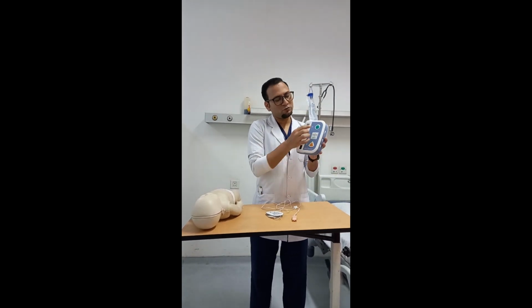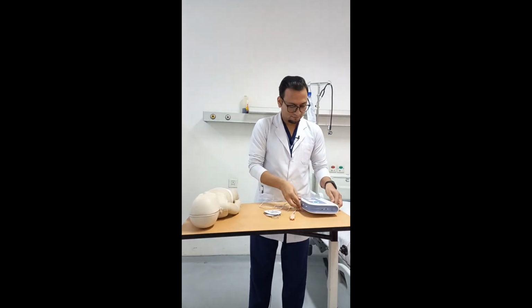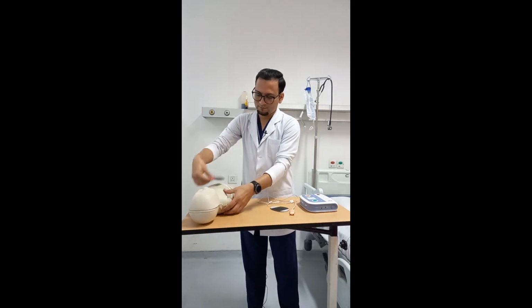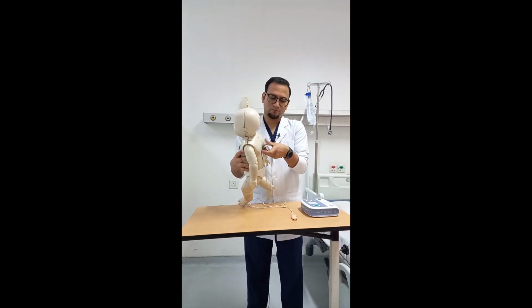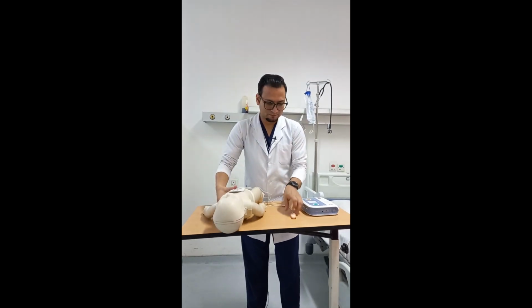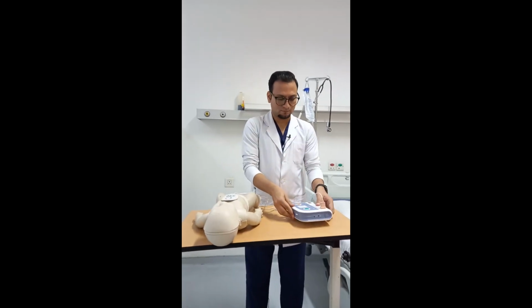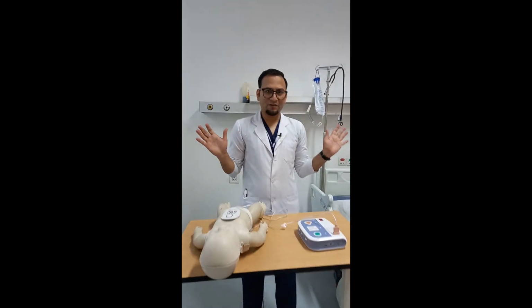First we have to press the on button. Apply pad to patient's bare chest. Plug in pad connector next to flashing light. Apply pad, plug in connector. Analyzing heart rhythm. Do not touch the patient. Stay away from the patient.